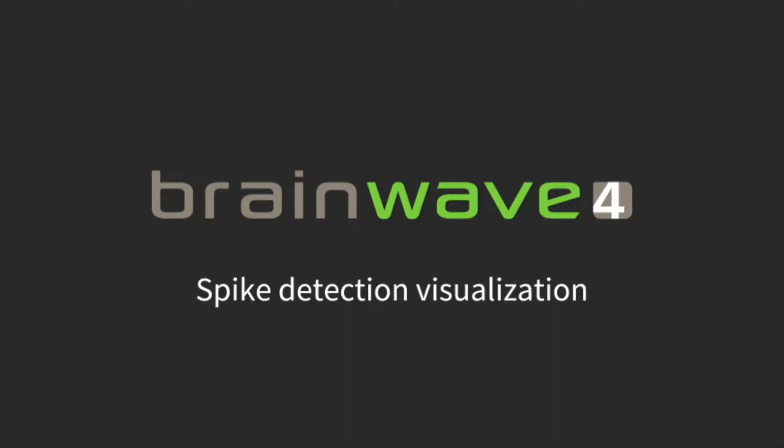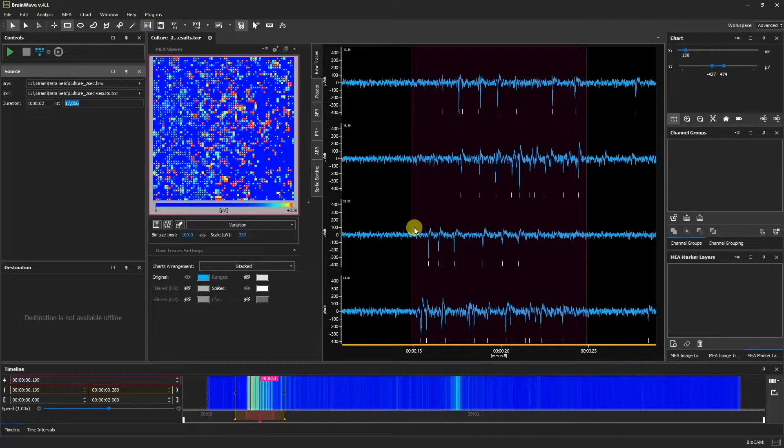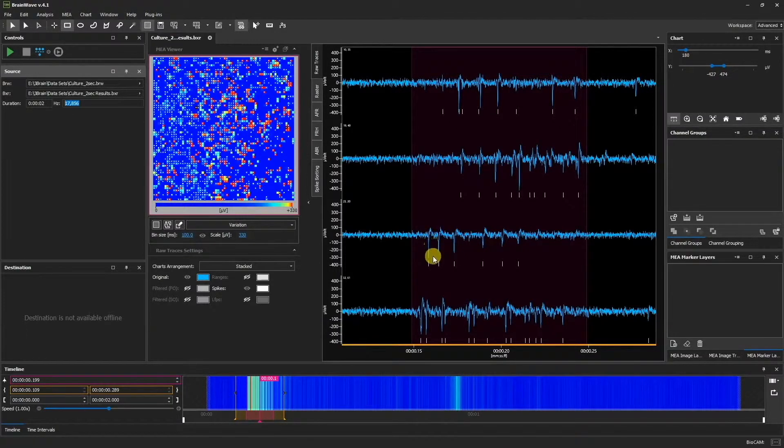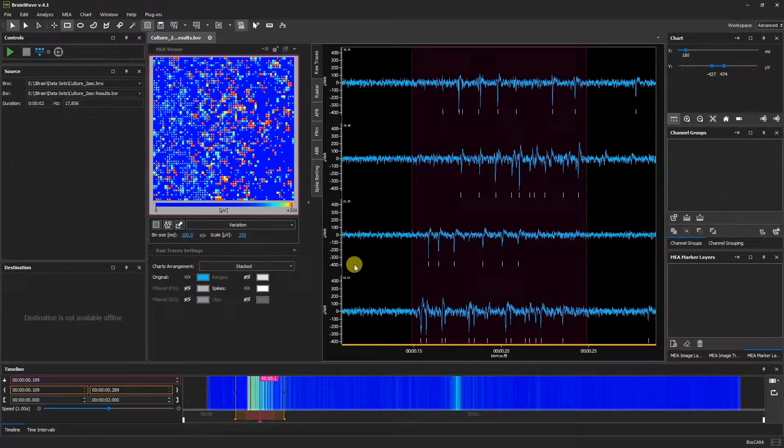Spike Detection Visualization. The detected spikes are represented in the Raw Traces window by these white vertical lines. Spike visualization in the Raw Traces window can also be disabled.